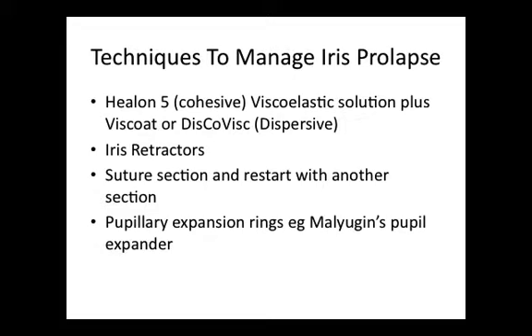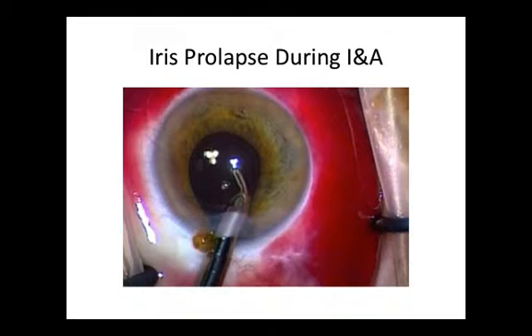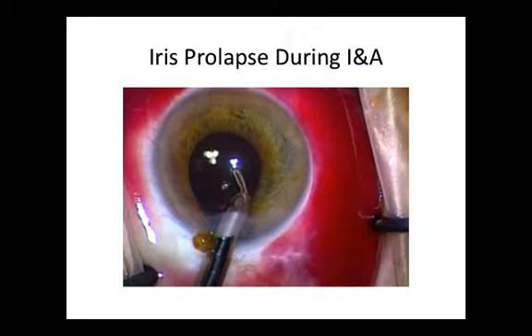Other less commonly used techniques include the use of pupillary expanders, of which there are various types. In this case, iris prolapse has occurred during I&A of the cortex. Sometimes if this occurs at the end of this stage, one can deliberately change one's grip and push sideways to prevent further iris prolapse from the section — that is, to create a physical block in the section with the I&A probe.